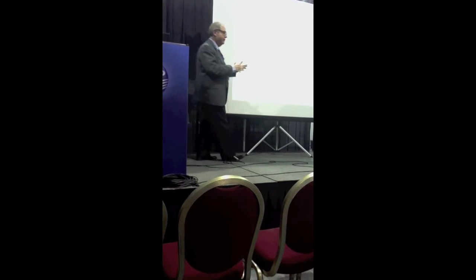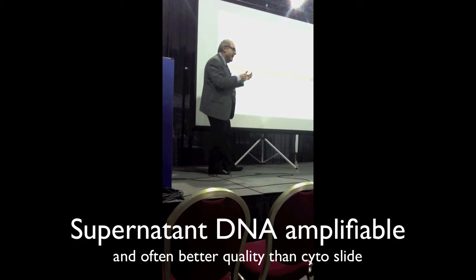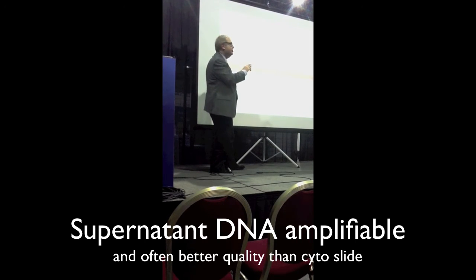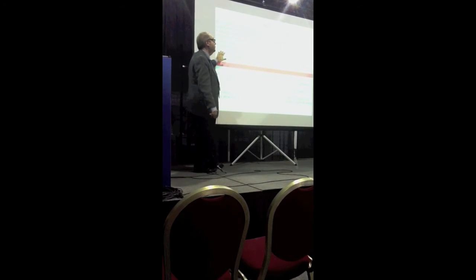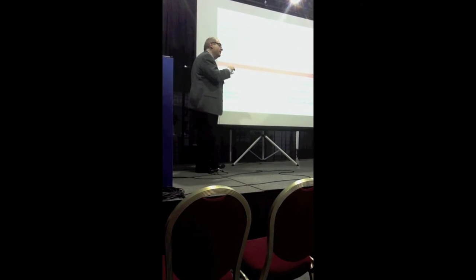The conclusions are these. The supernatant fluid that is gathered during the normal course of cytology preparation contains free DNA that likely represents the most actively growing cells that are in where that needle aspiration occurred. There is DNA, it is amplifiable, it can show more mutations, it can show more mutated cells for a particular mutation than the cells. The cases that were positive were better characterized by the supernatant than by the microdissected cells.